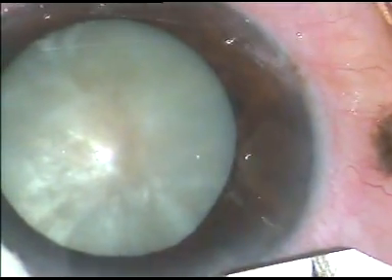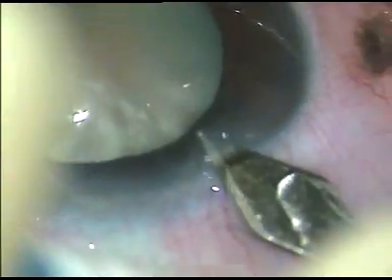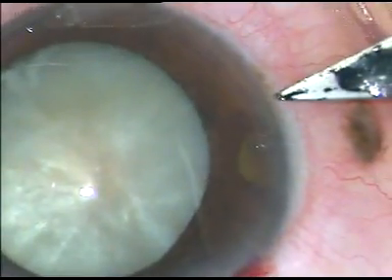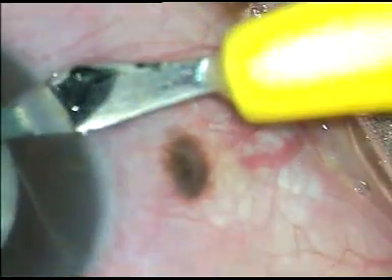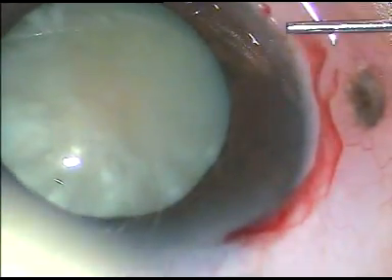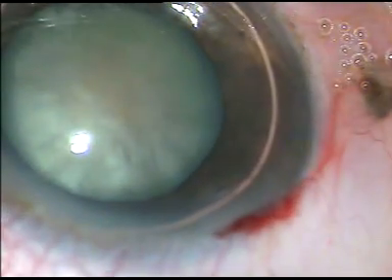Friends, we know that femto laser is very useful in doing capsulorhexis in intumescent and pre-intumescent cataracts, where if we try to do manual rhexis, the rhexis tends to run to the periphery. But if you don't have a femto, this is the way to go.